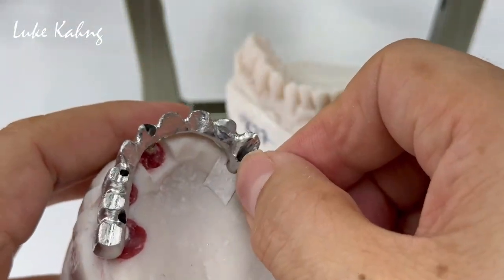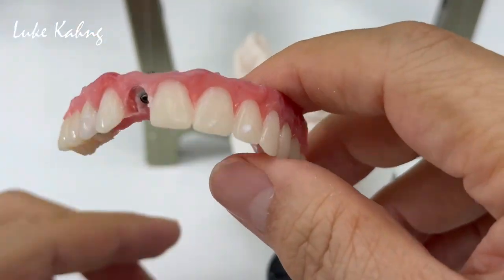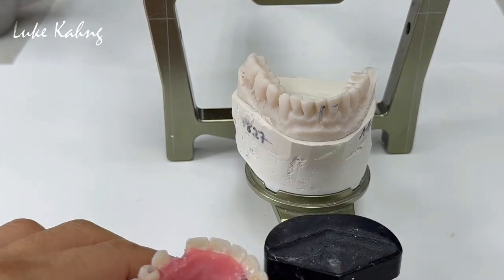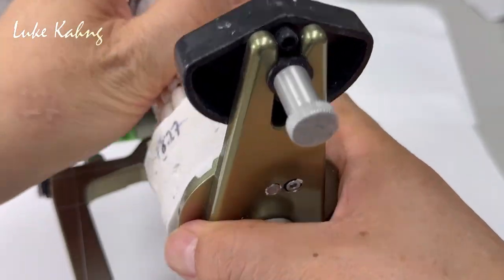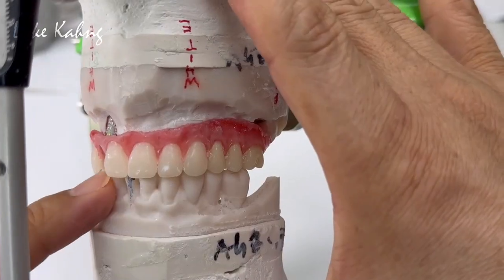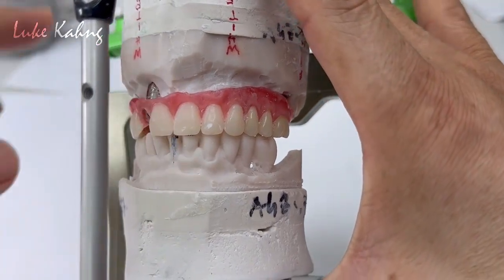So the game plan is here — trying to set the information between the tissue and the bite. This is very imperative; it's very important to set the tissue height and the incisor length and incisor position.